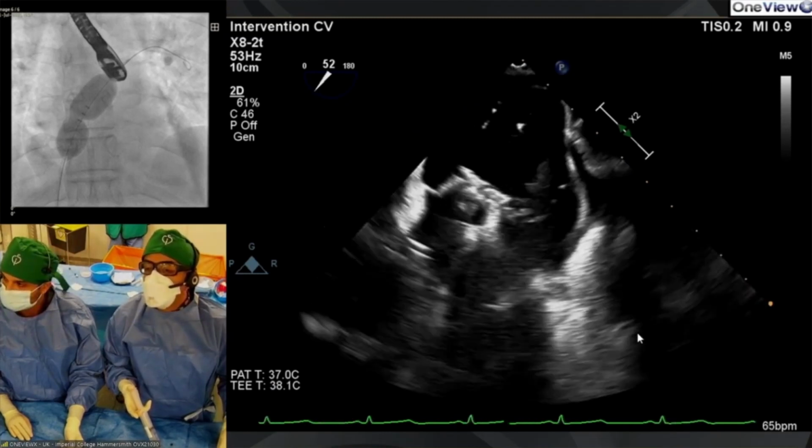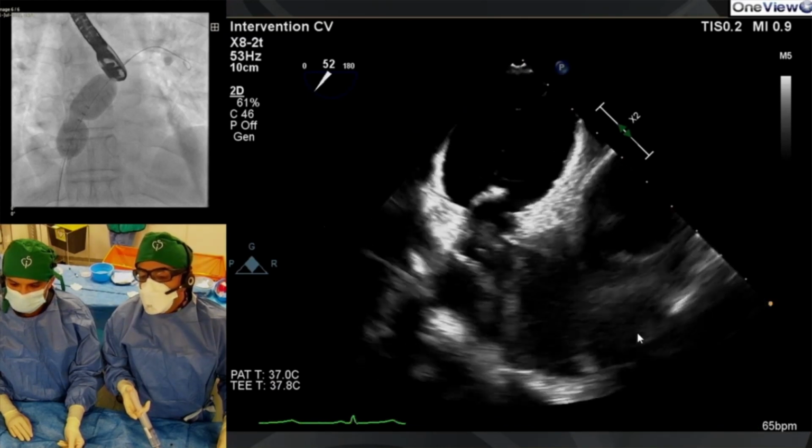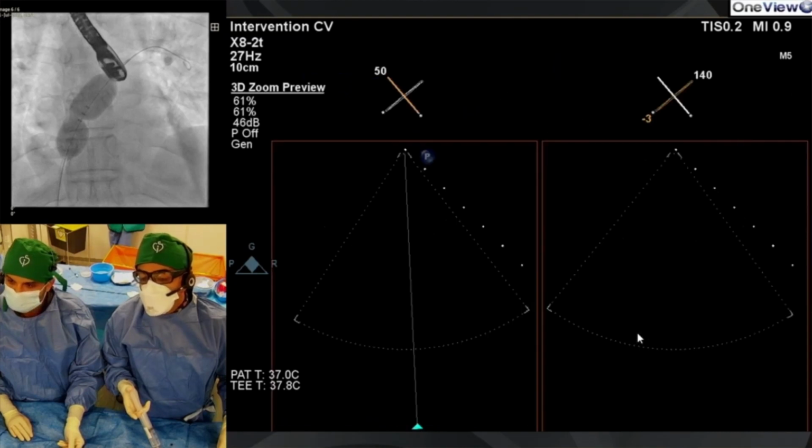Question is, what size is the balloon? It'll be a 10mm PFO. So those markers, the little markers are 5. So the top to the bottom marker is a 10mm distance. So that's about 11 probably, 11 millimeters. I'm getting between 10 and 12 on echo. So the waist is 11 and on echo it's 12.